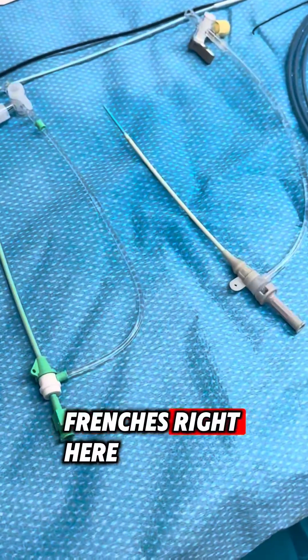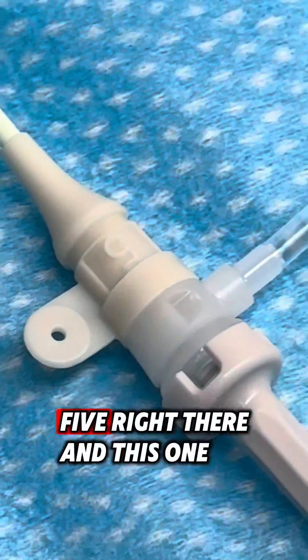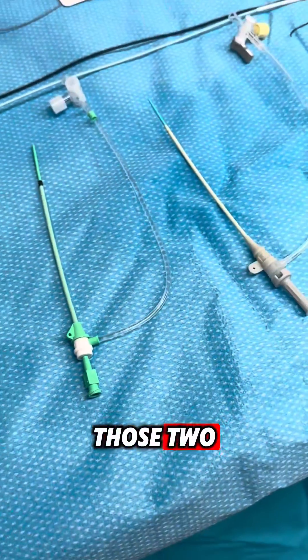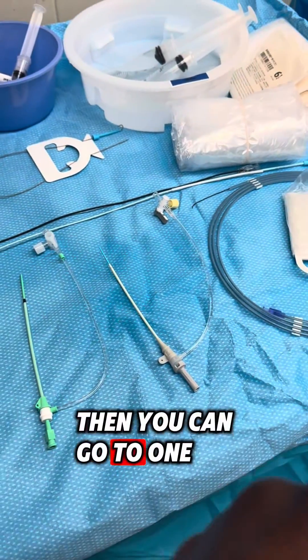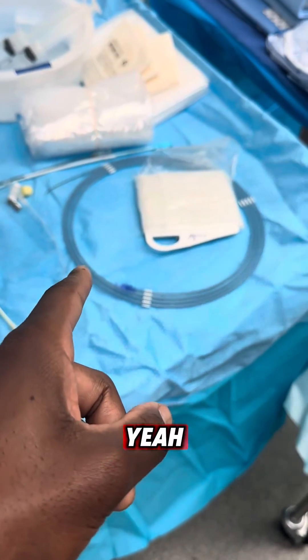These are the five French sheaths right here. Sometimes it's five or six — you can see the five right there. This one doesn't have a number on it, but it'll be one of those two. Then after you do that, you send down one of those catheters and put the wire in the catheter.